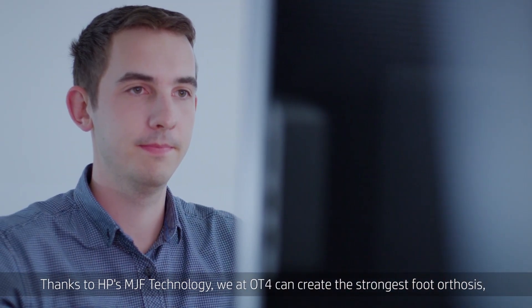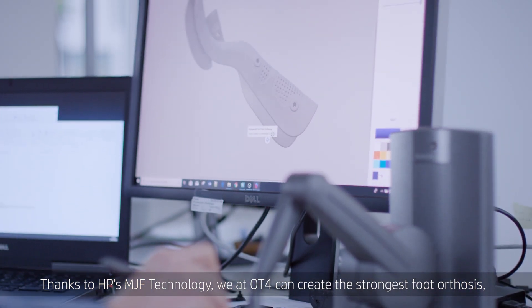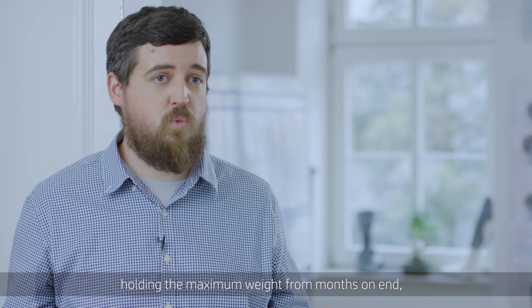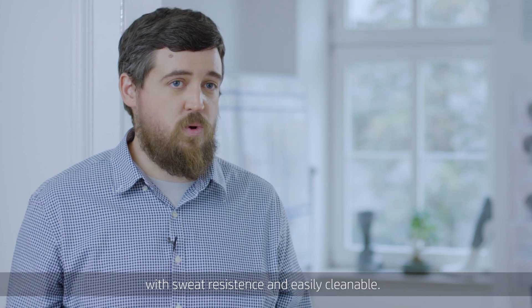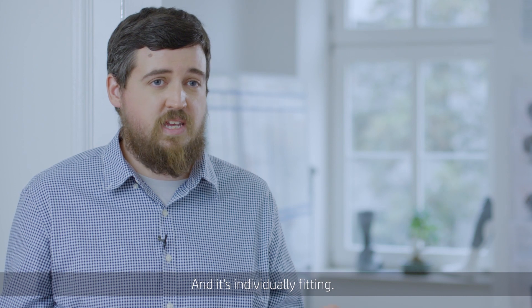Thanks to HP's MJF technology, we at OT4 can create the strongest foot orthosis, holding the maximum weight for months on end, with sweat resistance, easily cleanable, and individually fitting.